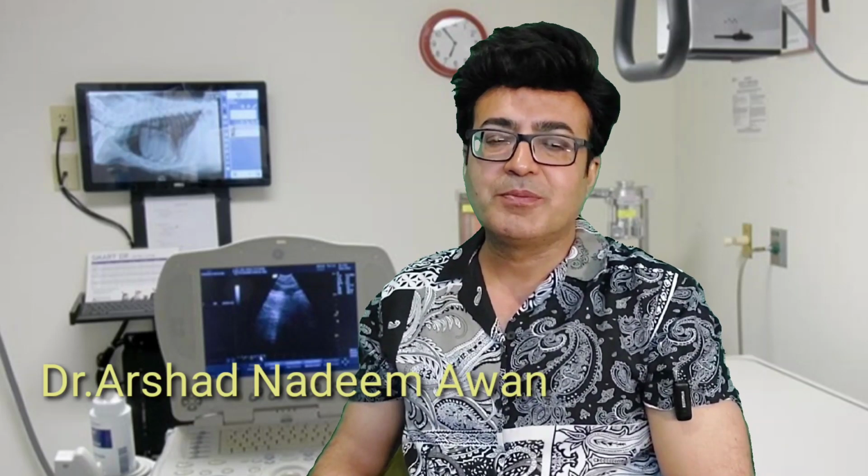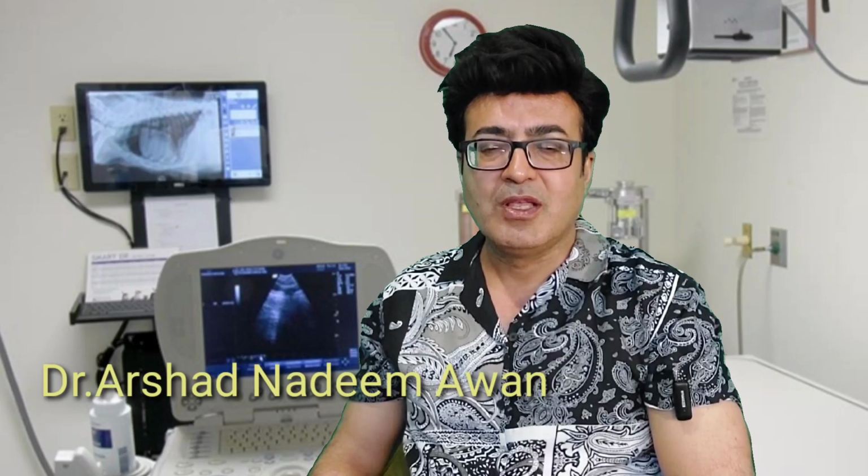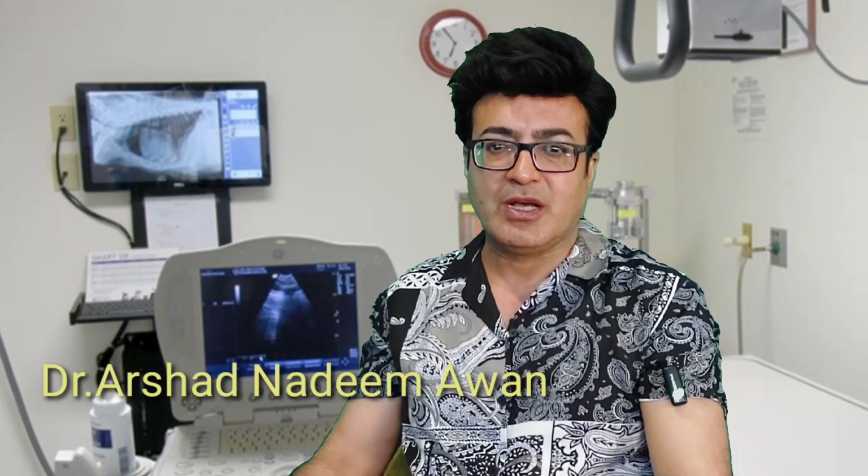Today my topic of discussion is pregnancy associated ovarian syndrome. Pregnancy associated ovarian syndromes are multiple. There are particular names for all of these, like hyperstimulating ovarian syndrome or ovarian stimulation syndrome. There are also some other names being given by the authors. So how these will appear on ultrasound imaging, how we will pick the points, and how we will label all these names, this video will include all this information. So let's start watching these images and you will be able to pick the points related to pregnancy associated ovarian syndrome.